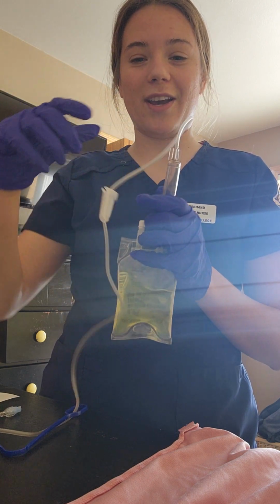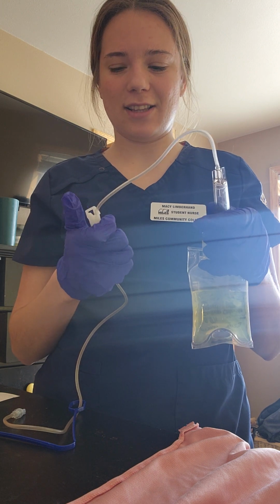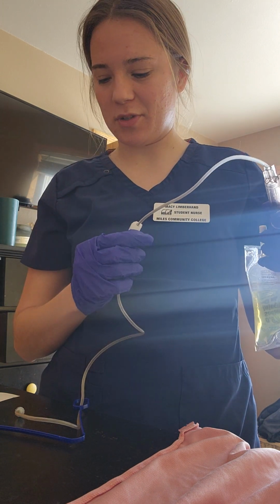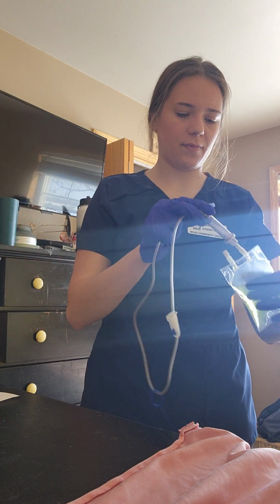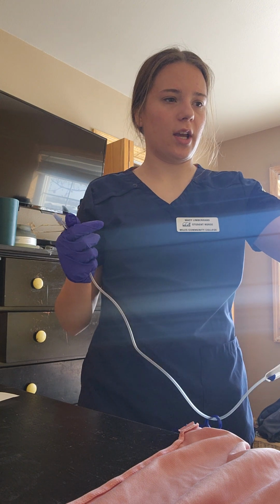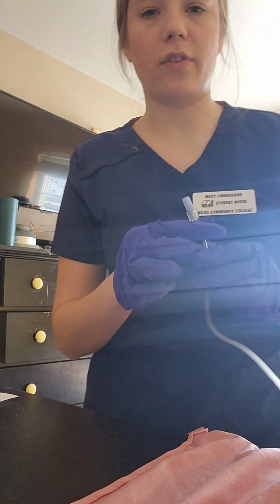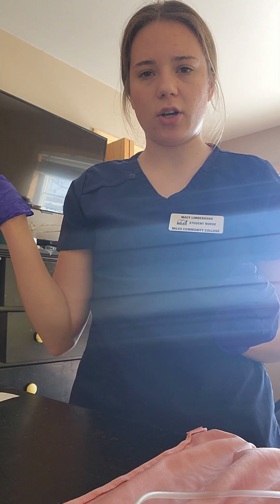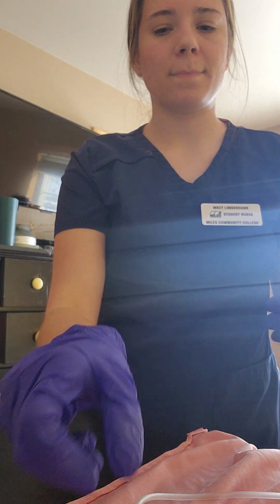Okay. Oh, and before I spike this bag, I would make sure that my clamp is set so that we don't make a huge mess. Okay. Then I will go ahead and hang this with my makeshift IV pole. So when I hang my IV Piggy Back, I would make sure to hang it higher because whatever is higher is the one that's going to run.